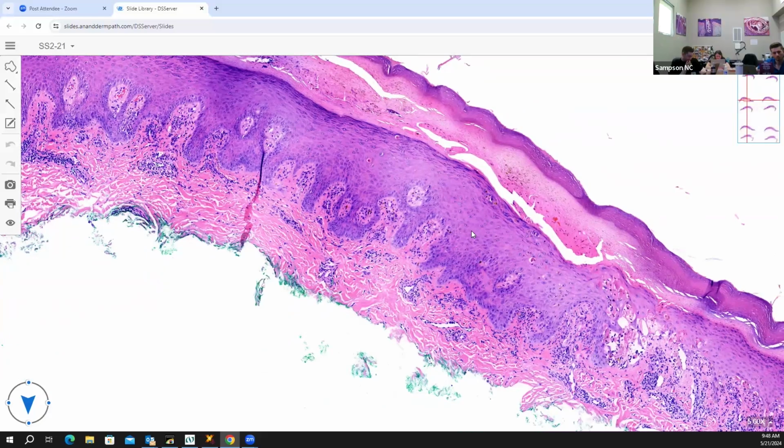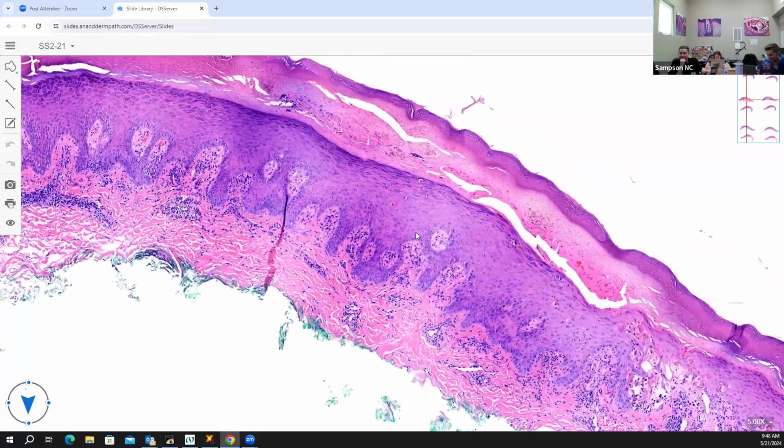And then PLC, there'd be more stratum corneum changes. So this could be PLC versus EM, but EM would probably have pigment; they wouldn't have pigment dropout. So maybe pityriasis lichenoides. It's EM. It's erythema multiforme. Yes. It's a beautiful location.